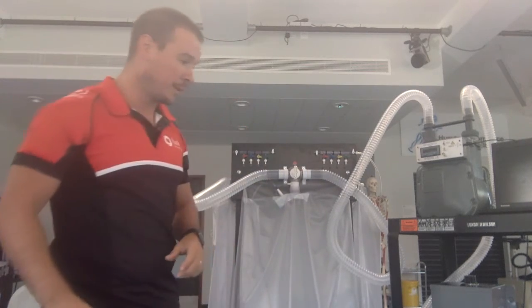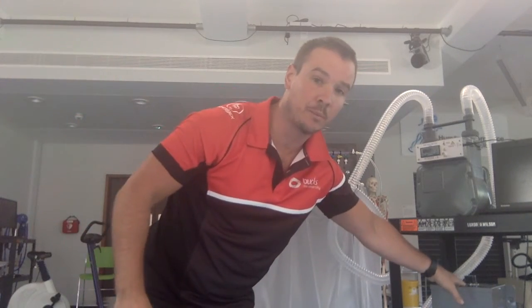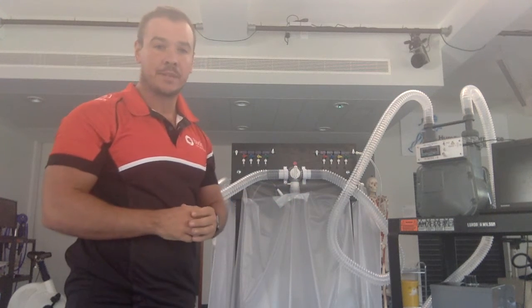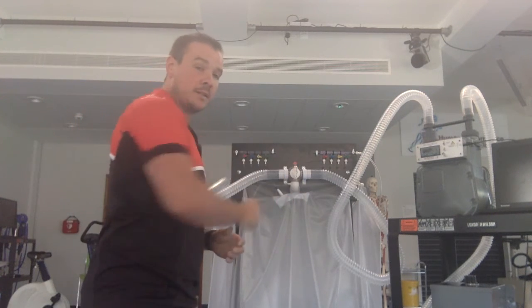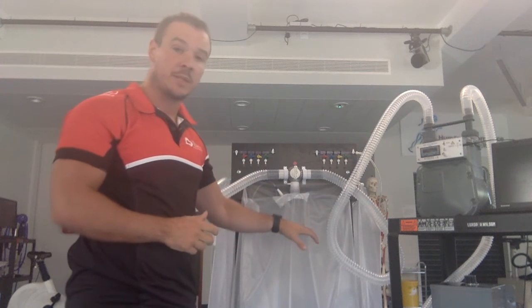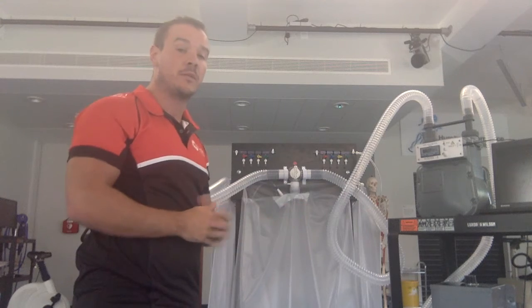Ensure that your Douglas bag is open and switch the vacuum pump on. When the Douglas bag is empty, make sure that you shut it before you switch off the vacuum pump. This creates a vacuum in the bag and prevents the backflow of any air.